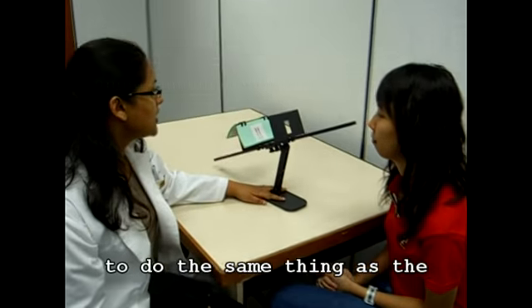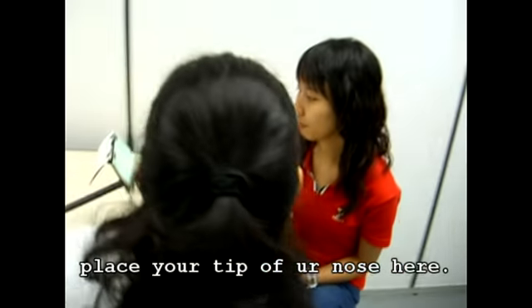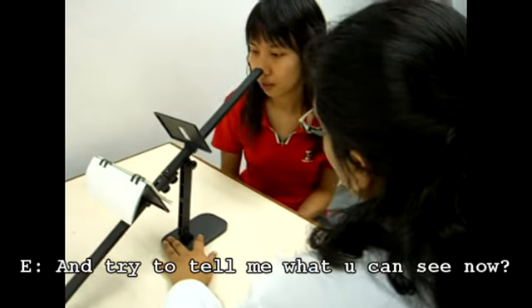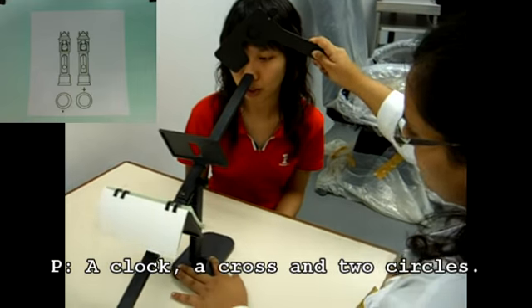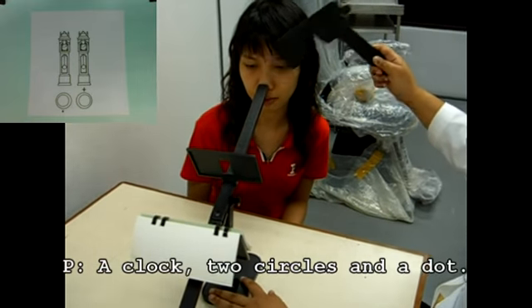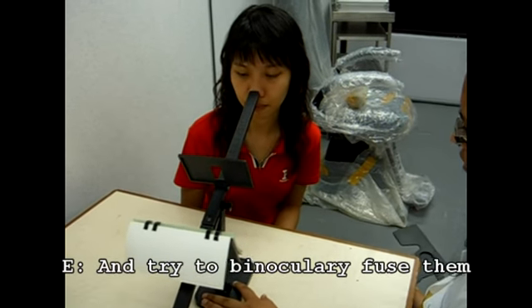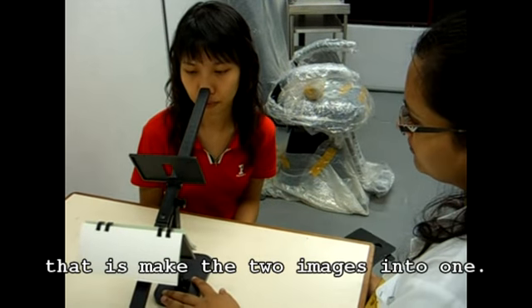I'm going to ask you to do the same thing as you did with the previous visit. I'm going to ask you to place the tip of your nose here and try to tell me what you can see now. Clock, a cross, and 2 circles. What about now? A clock, 2 circles, and a dot. And try to binocularly fuse them. That is, make the two images into one.